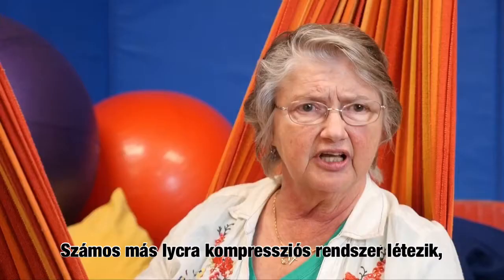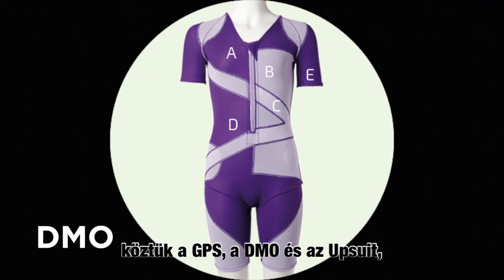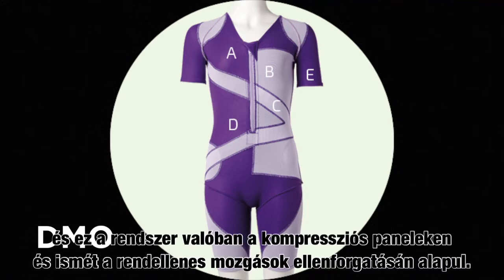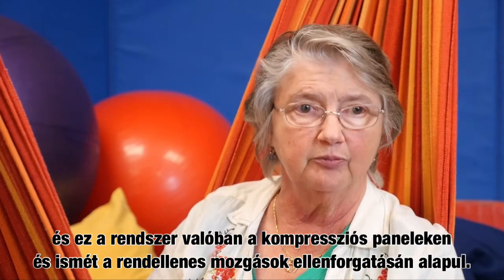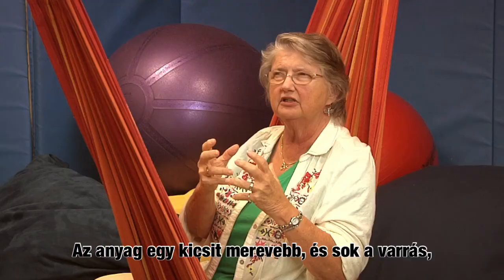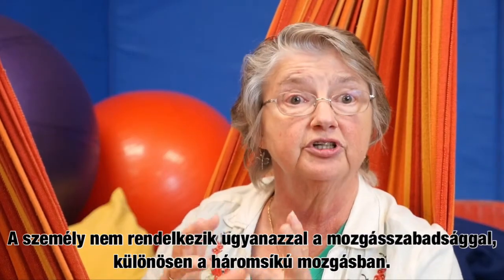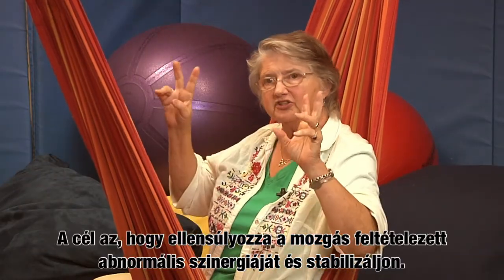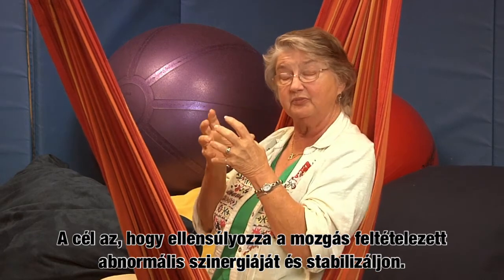So there are a number of other Lycra compression systems, including GPS, DMO, and Upsuit. This system is really based on panels of compression and, again, counter rotation to abnormal movements. The material is a little stiffer, and there are many seams, and it makes the orthosis not have as much growth potential as the Spio orthosis. The person doesn't have the same freedom of motion, especially in triplanar motion. The objective is to counteract what is thought to be an abnormal synergy of movement and to stabilize. That piece is the same.